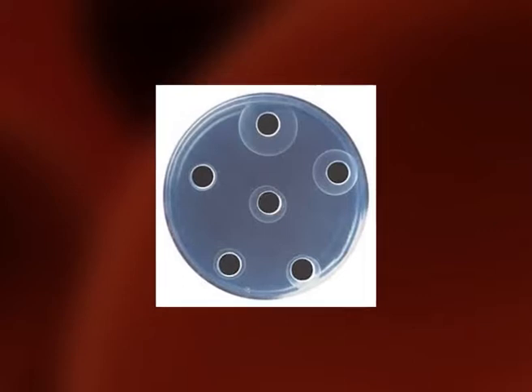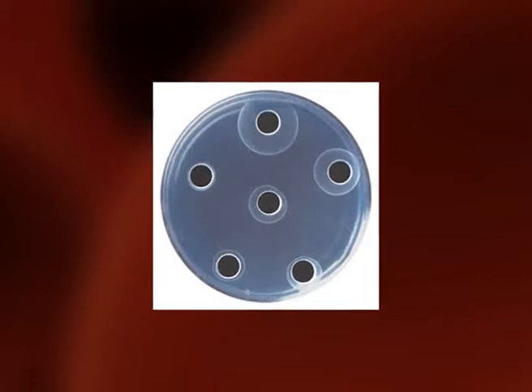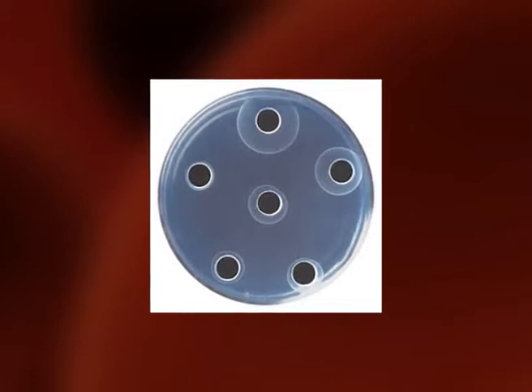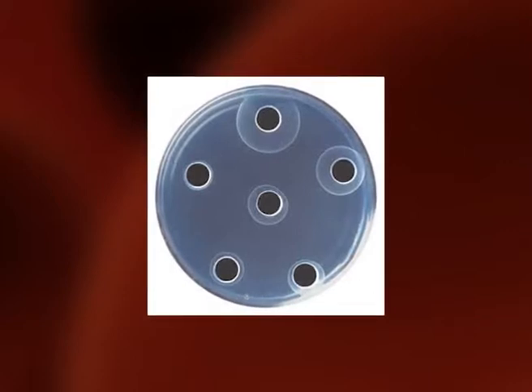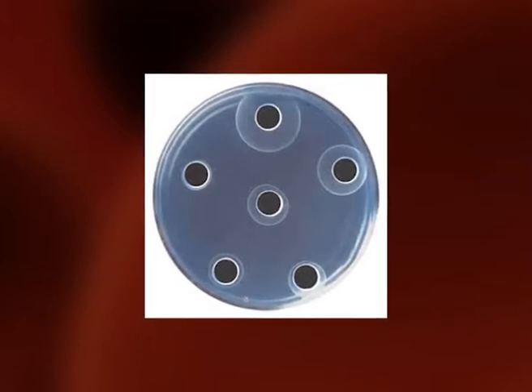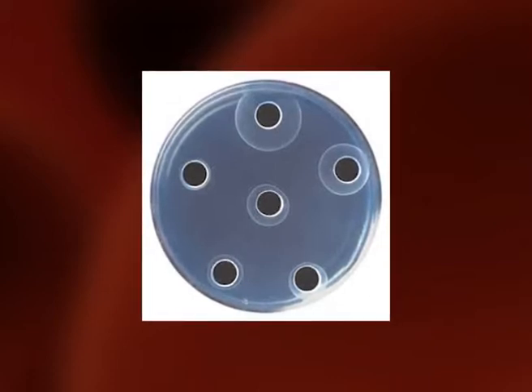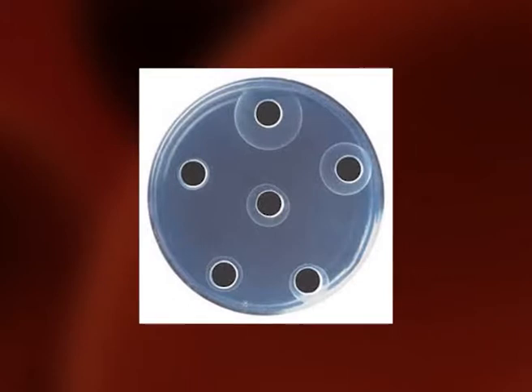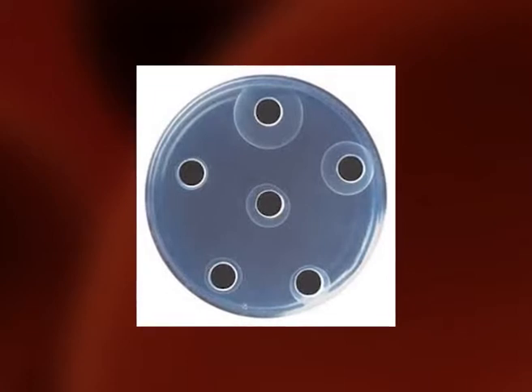One serology technique based on this principle is radial immunodiffusion, a single diffusion method in which a concentration gradient is established for an antigen. The antibody is uniformly distributed in the gel matrix. The antigen is loaded into a sample well and allowed to diffuse from the well into the gel until a precipitation reaction occurs. The precipitate ring around the well is observed. The area within the ring of precipitate is proportional to the amount of antigen loaded in the well.